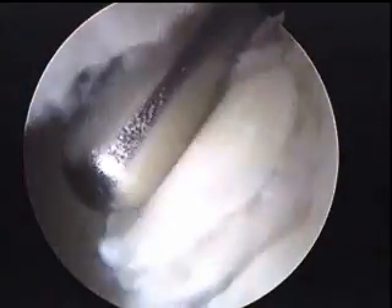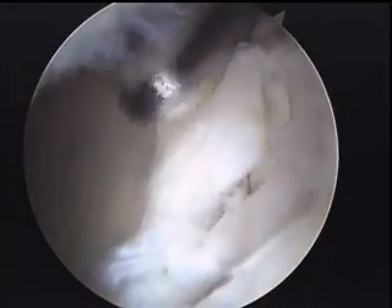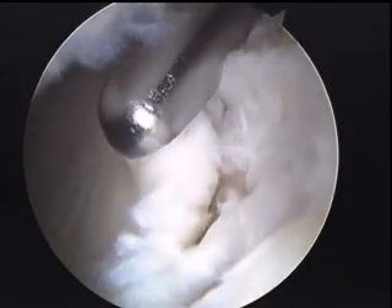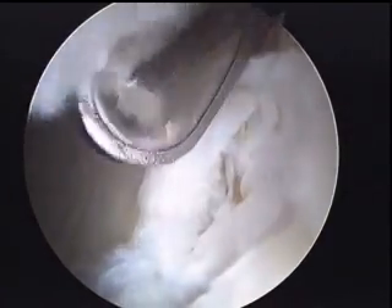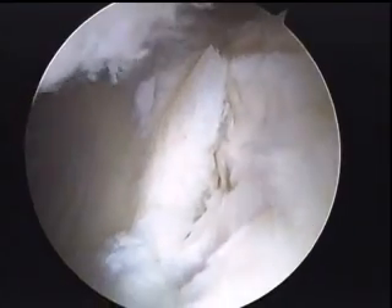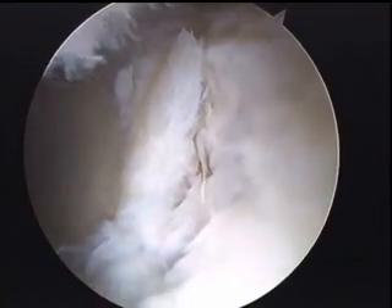Now what we've done here is we are in between the acetabulum rim and the labrum. The labrum is actually up on our left. This is the delamination of the unstable cartilage at the rim of the acetabulum. We're using a special shaver here to get rid of the unstable cartilage. If this was left in, it would most likely continue tearing and cause more problems in the area.